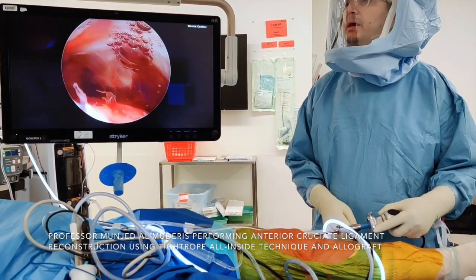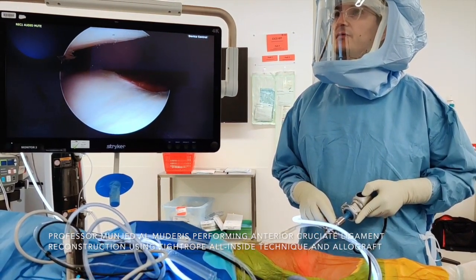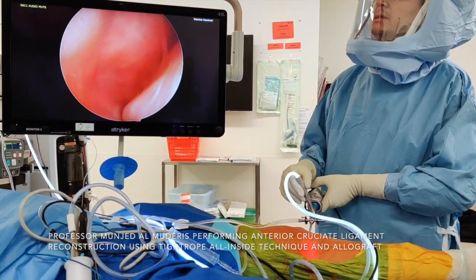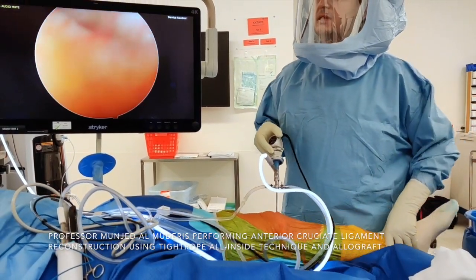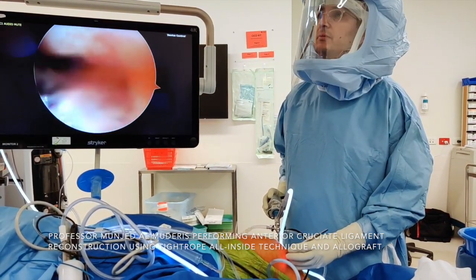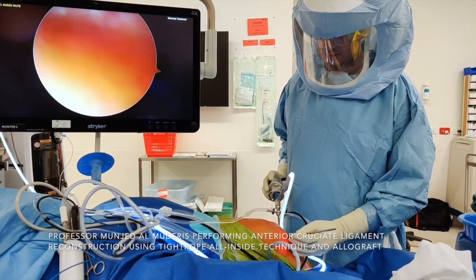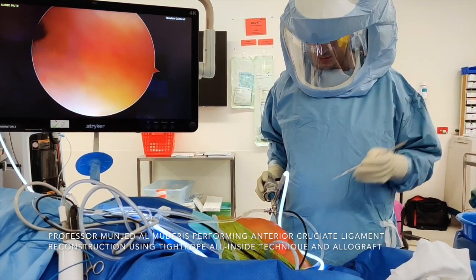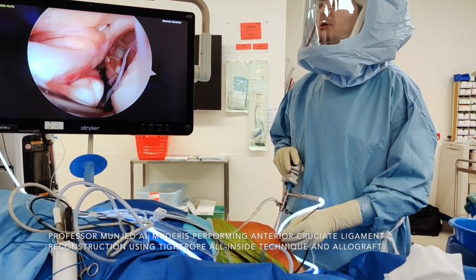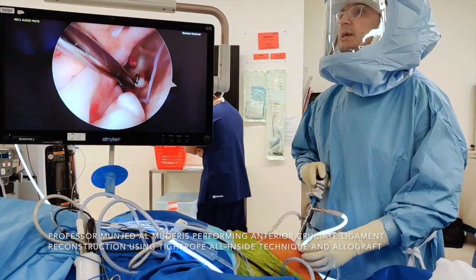Looking at the suprapatellar pouch, the anterior surface of the patella — there is some chondral damage. The lateral gutter, the medial gutter, then we move to the medial compartment. I then insert my anteromedial portal, performed under direct vision. I know the size of the graft is 10 mm, so we need to make the portal large enough to accommodate the graft. I insert the probe and you can see the posterior cruciate ligament is completely normal.